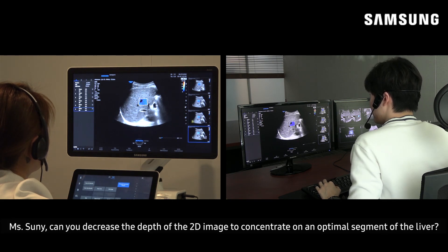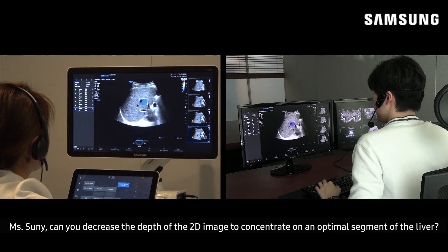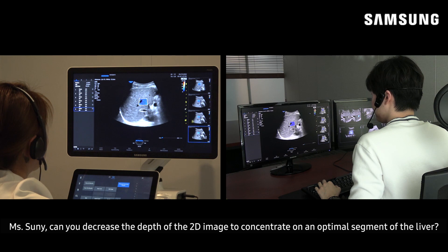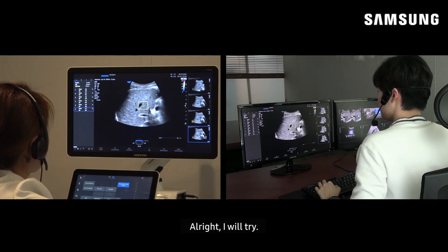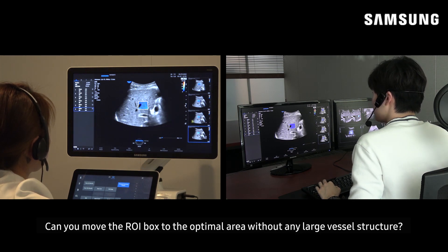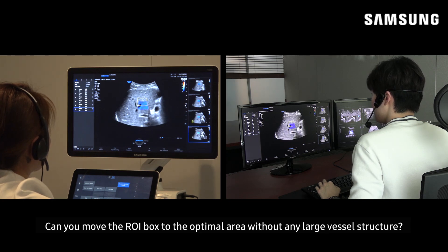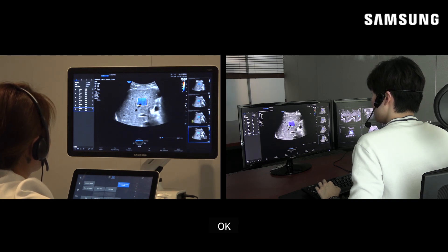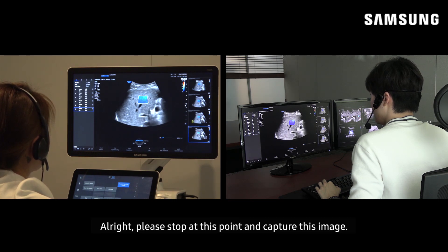Would you please hold your breath for a second? Ms. Sunny, can you decrease the depth of the 2D image to concentrate on an optimal segment of the liver? Alright, I'm trying. Thank you. Could you move the ROI box to an optimal area without any vessel structures? Okay. There we go. Please stop at this point and capture this image.